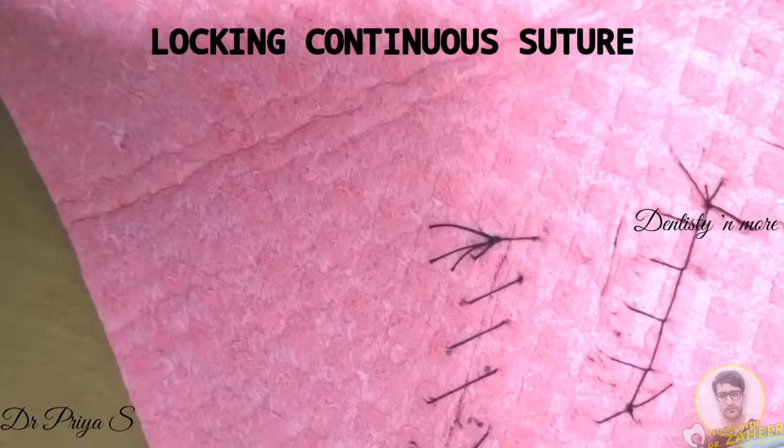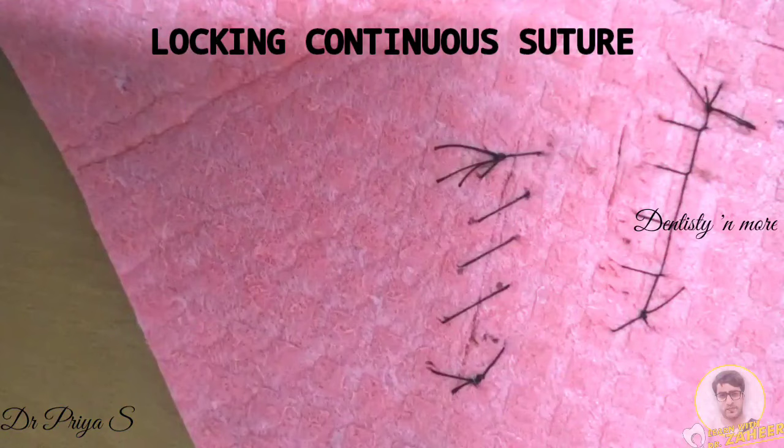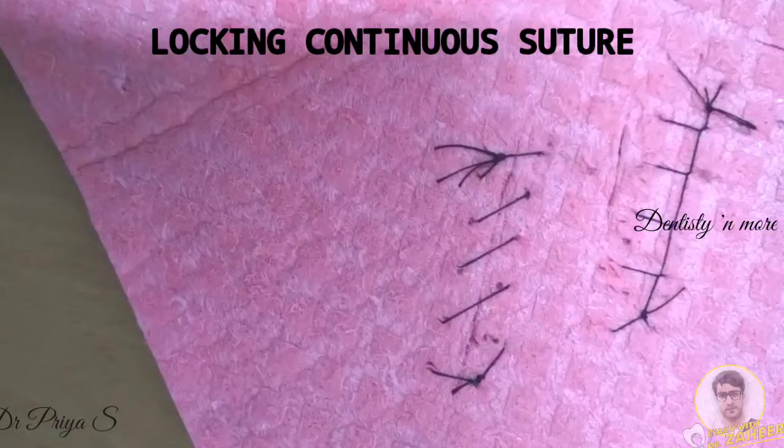Here is your simple continuous suture — you can compare both of them. The advantage of locking continuous suture is that due to the locking mechanism, the tissue aligns itself perpendicular to the incision. It also prevents continuous tightening of the suture as wound closure progresses. That's all for this video about suturing techniques. Thank you.